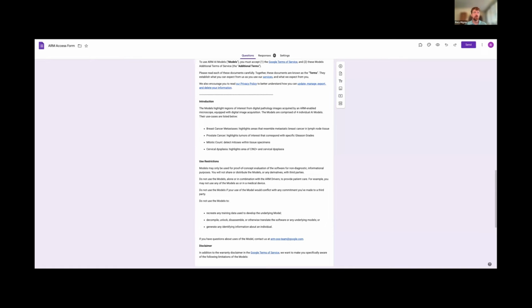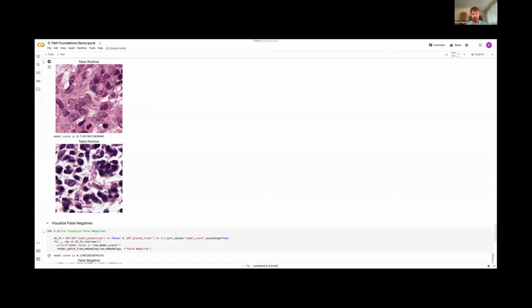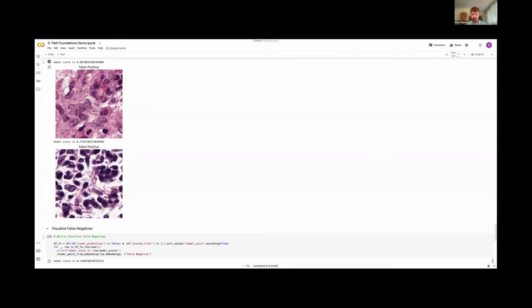And I'll just share what the size of those patches tend to look like. So this kind of size of image here. This is obviously a very small patch. It's a 40x, I think. Versus, there are thousands of those in a whole slide image, of course. So this is a very small portion of that. So we might have thousands of slides in these original models. This is the ARM original models, but millions and millions of patches because each slide has so many there.